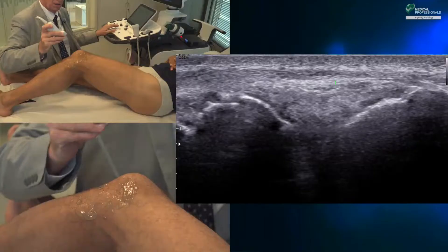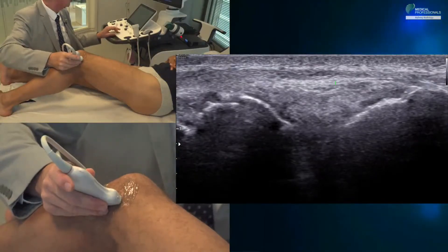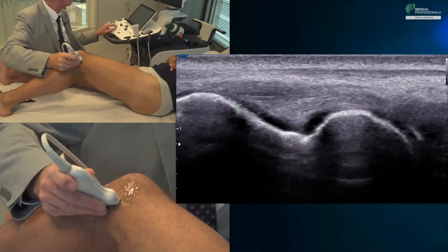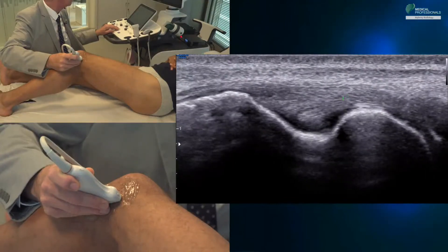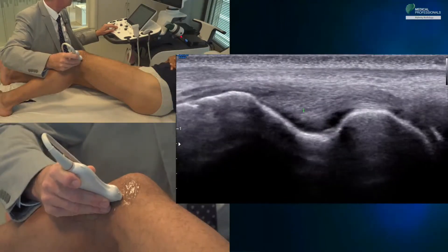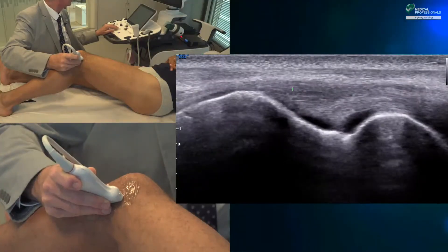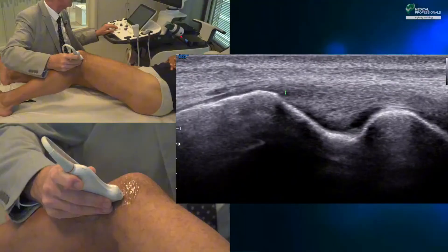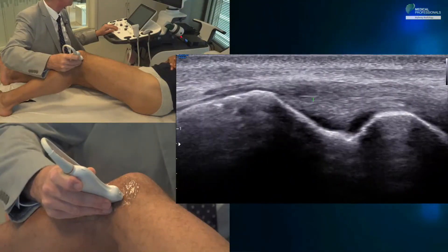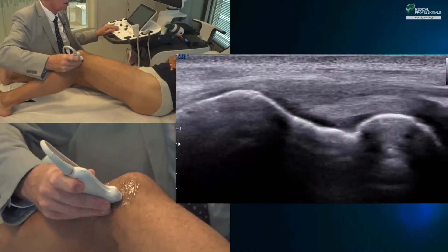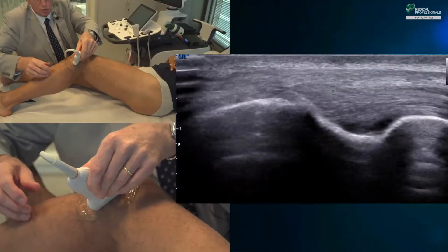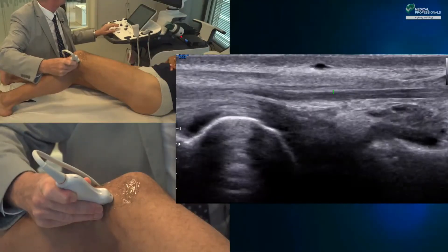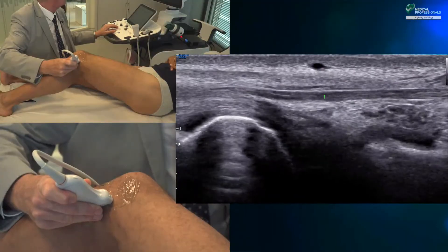On this section we have the femur, lateral meniscus, tibia, and the anterolateral ligament. We now position the probe on the lateral part of the femur. There is an important bony landmark: a notch in which the popliteal tendon is inserted, which we will analyze later. We identify the iliotibial band going up to the iliac crest and see that the lateral collateral ligament is inserted just above the popliteal tendon attachment. Making a small probe rotation toward the head of the fibula, we visualize the lateral collateral ligament perfectly on the surface of the external or lateral meniscus.